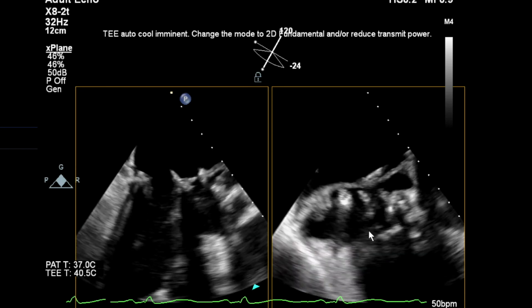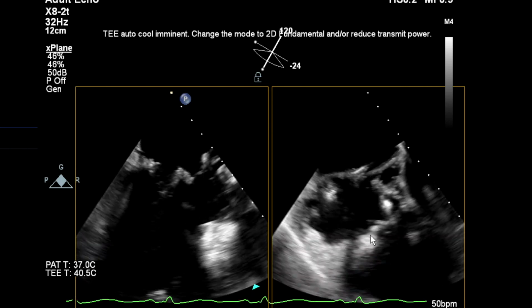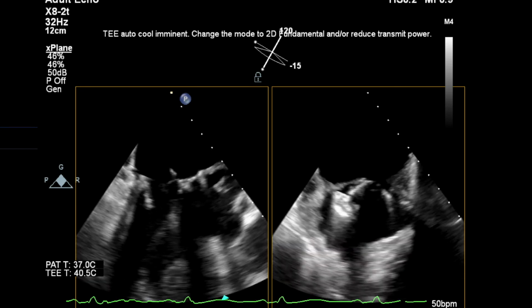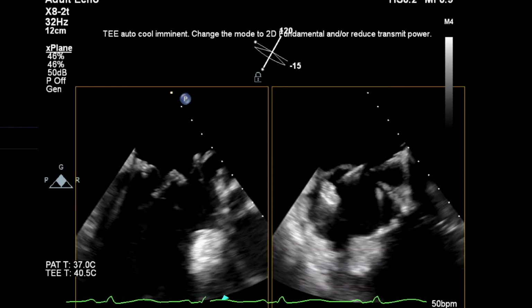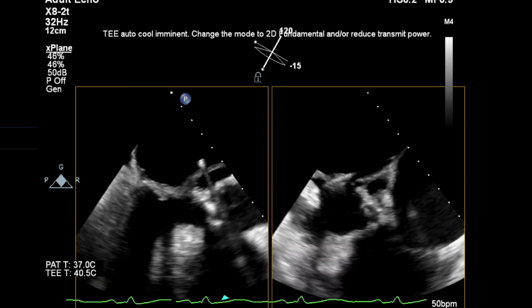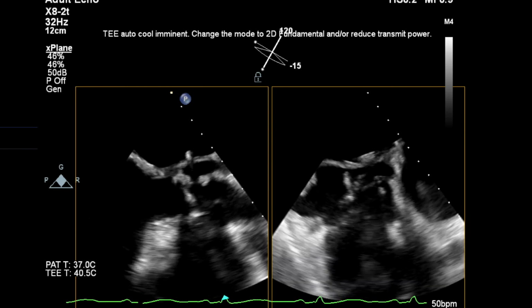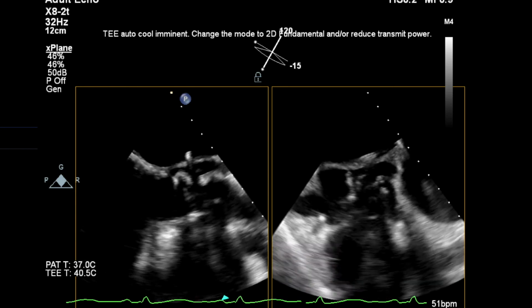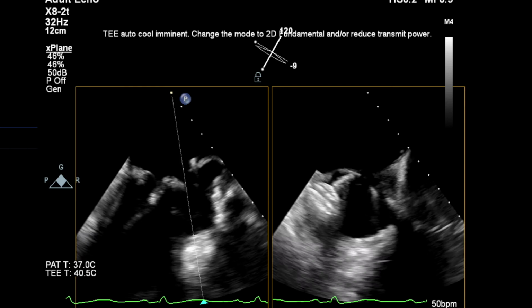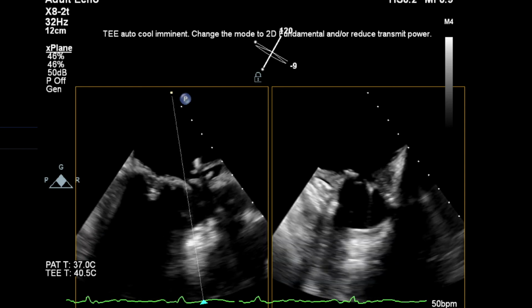Yeah. So I'm just going to push in a bit, which it's allowing me to do just about. I've just changed my orientation, and I think I want to rotate it a bit more personally. So I'm going to push through a little bit more and see if I can rotate this. Just going to look for you. These devices are very difficult to rotate.